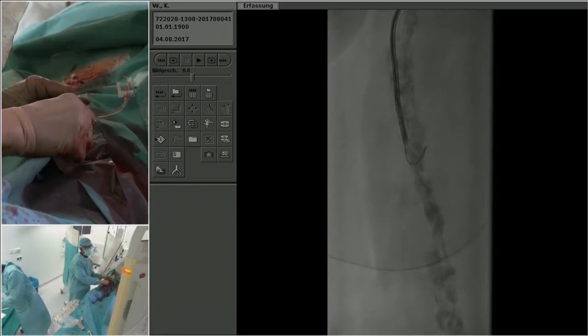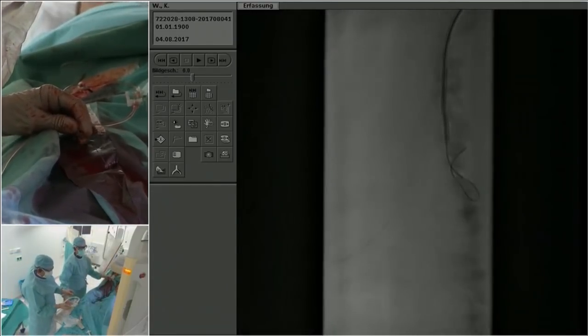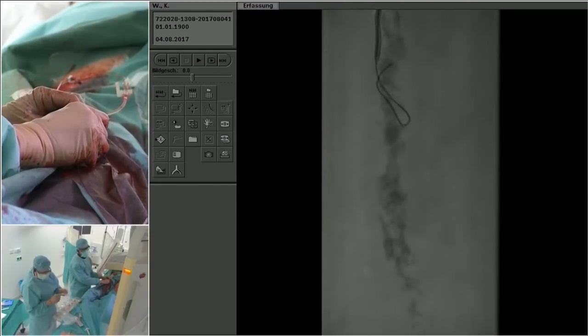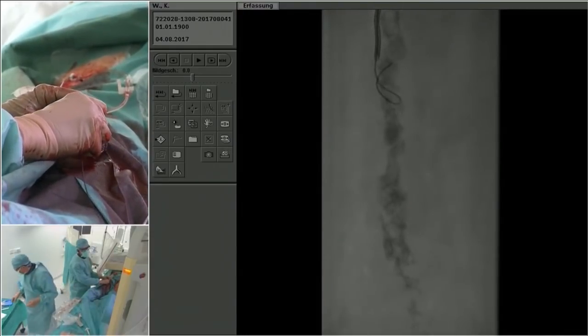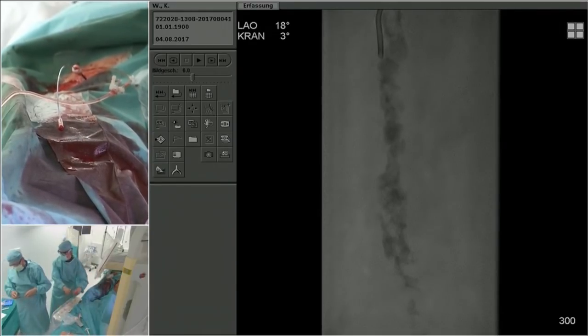Yeah, the difficulty here remains the same. Even if you start that subintimal plane, re-entering is going to be extraordinarily challenging. So we actually learned from Andrej and these guys the half-hour rule. If we're not getting it quickly, we just go retrograde and create that subintimal rendezvous. Makes sense. Ian, a question for you.